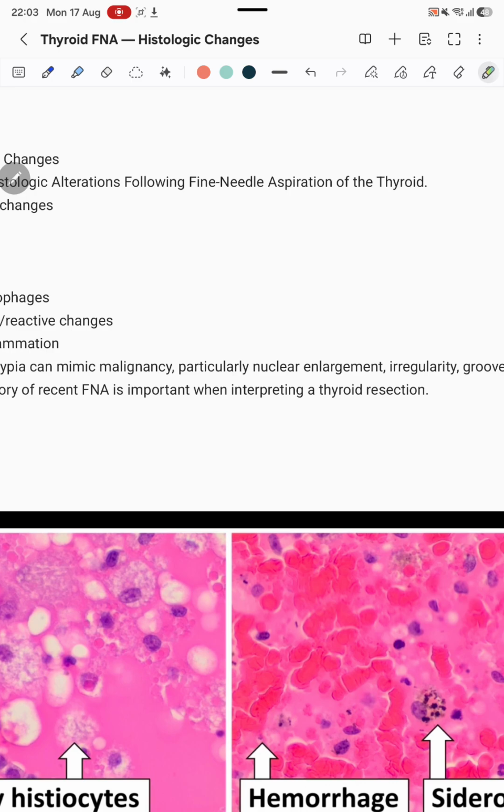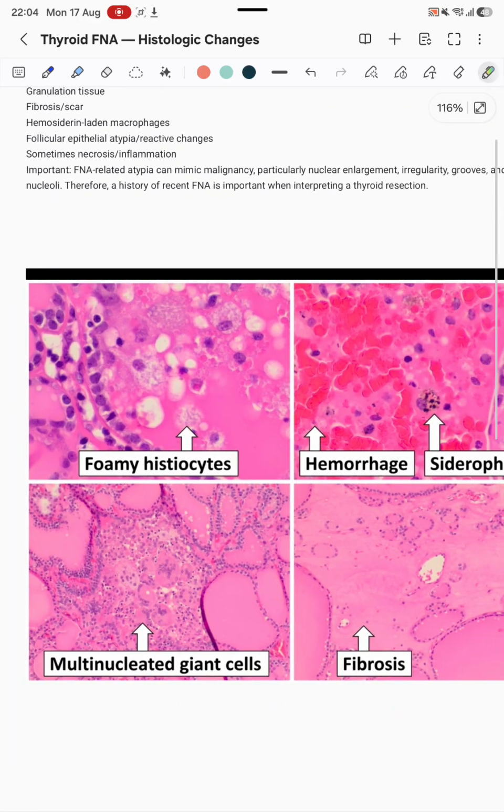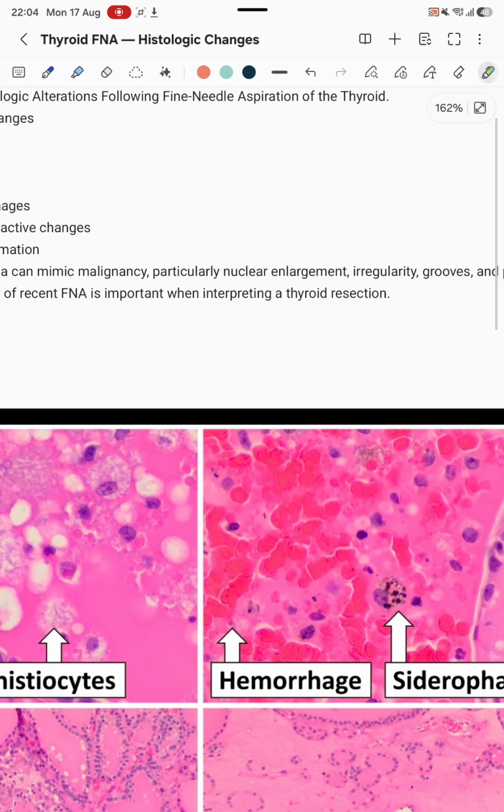So you don't want to just say this patient has a malignancy when all of the tissue is normal except the area where the FNA was taken. You should know that this area was where the FNA was taken, because you should follow where the FNA was taken from in the previous biopsies. So the problem is, of course, you're going to have nuclear enlargement, which should strike you.